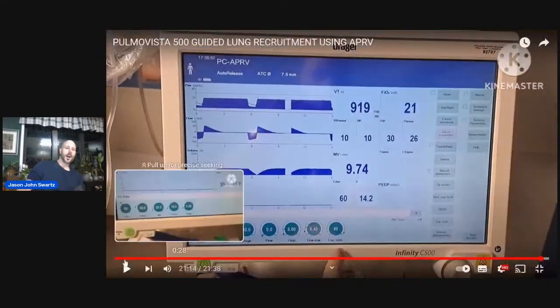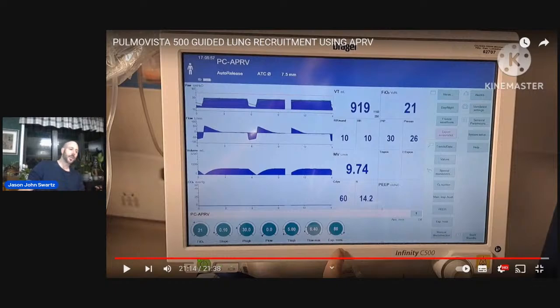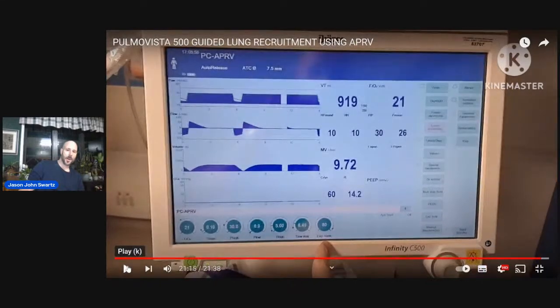I also just posted this case study that I did today, but I felt like I needed to do a live stream to watch it and explain it because, you know, you're throwing your work out there. I was like, I gotta do a live stream and kind of explain why this is that high, since the blood gas was normal. What do you think? Am I bad? Is this incompetence? What are your opinions? Do you agree, or are you like, no, this is dangerous? What is this guy doing?